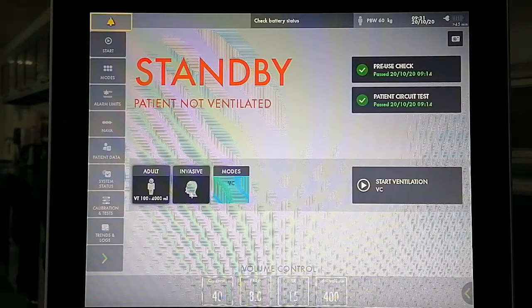This is your Captain RT, and I'm here to discuss with you how to set the ServoU ventilator in various modes of ventilation. So I will basically not explain the guidelines on how to set, but rather just go through the screen and the parameters that we need to set during each mode of ventilation.